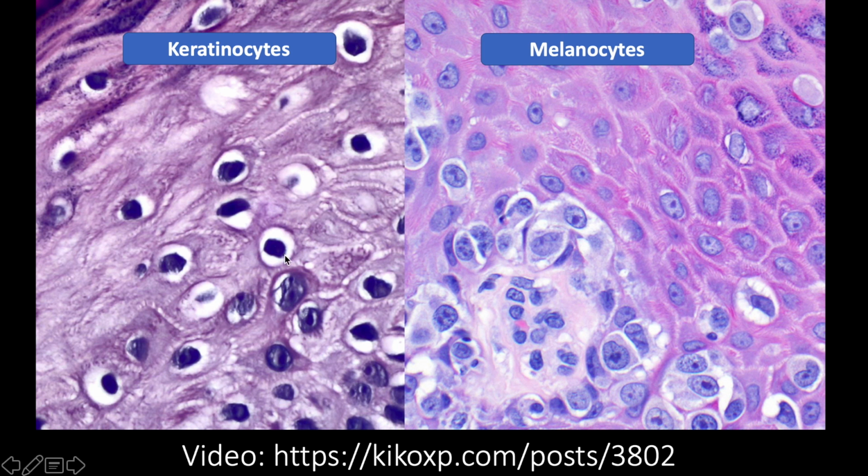Keratinocyte vacuoles are around the nucleus. The nucleus is floating in the center of an empty space, a sad, lonely little keratinocyte nucleus, all naked and alone with no cytoplasm around it. Or sometimes keratinocytes have a signet ring look, where you get a crescent-shaped squished nucleus and then a clear space around it. I don't understand why those vacuoles happen in some cases and not in others. There's probably some good histology chemistry explanation, but I've never fully understood.